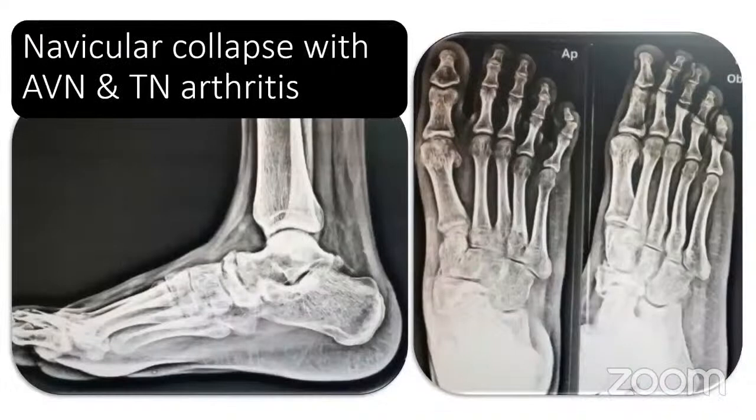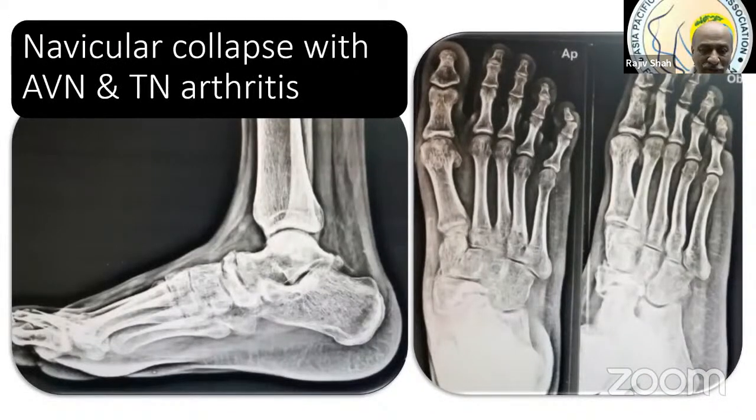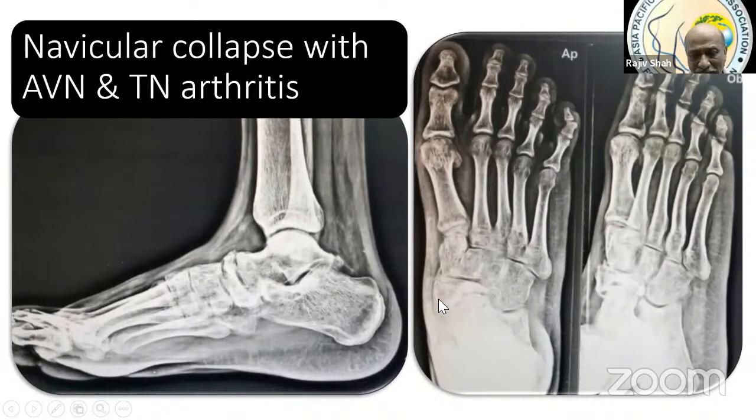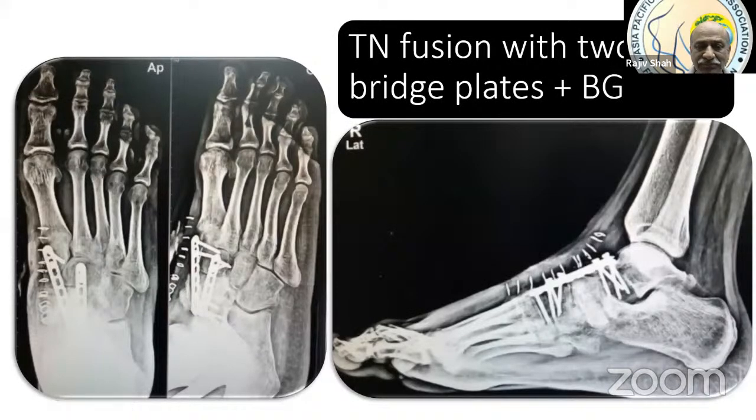And look at this. This was another case where there was a collapse of the navicular, almost like an AVN of the navicular and talonavicular arthritis. In such a case, you will have to excise it completely, put in one or two bone grafts, lengthen it and put in one or two plates. So talonavicular fusion with two bridge plates and bone grafting. And these bone grafts are solid bone grafts from the iliac crest.